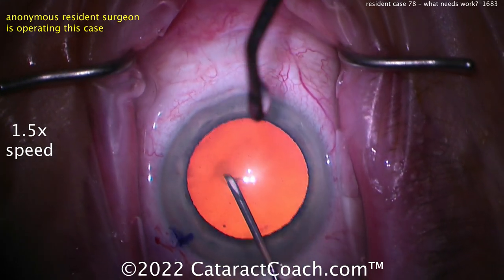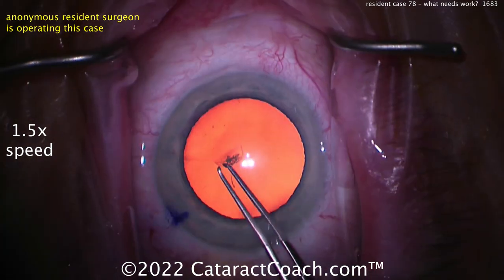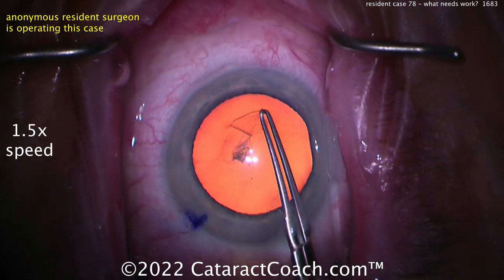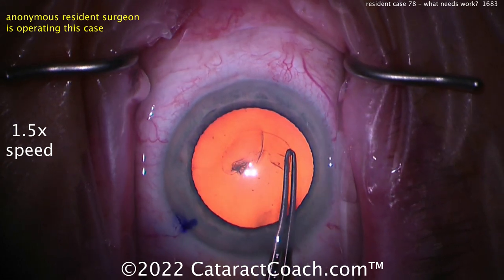Now time to make the rhexis. Let's see the rhexis — you can see the attending is squirting the eye. I'm not the attending for this case. Let's see the rhexis for case 78. Pretty good — I like the pivoting, pulling back there to keep it easy to grab.